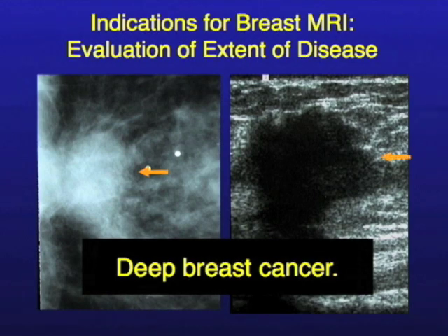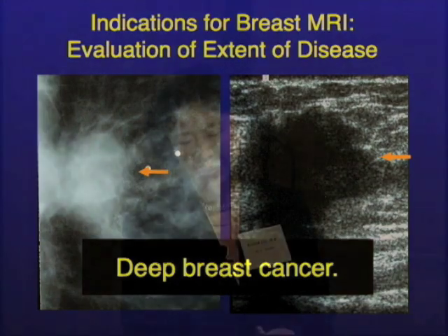And this is an ultrasound image showing the cancer here — this dark black spot. The question the clinician had, or the surgeon, was: is there chest wall invasion? Because we know the cancer is very deep, and we're not really seeing the back end of it on the mammogram. You just can't get back that far because the patient's chest wall is in the way.